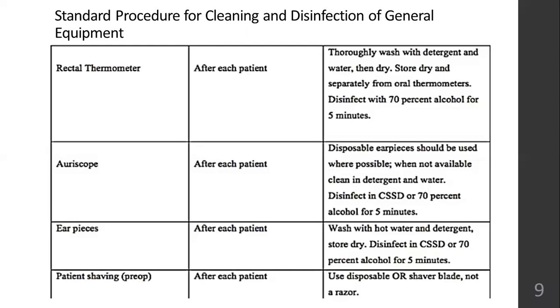Earpieces, after each patient, wash them in hot water and detergent, then disinfect in CSSD, because high level disinfection is used here. It is something that goes inside the patient's body, right? It goes inside one of the patient's orifices, so it has to be disinfected. Okay. 70% alcohol can also be used for 5 minutes.